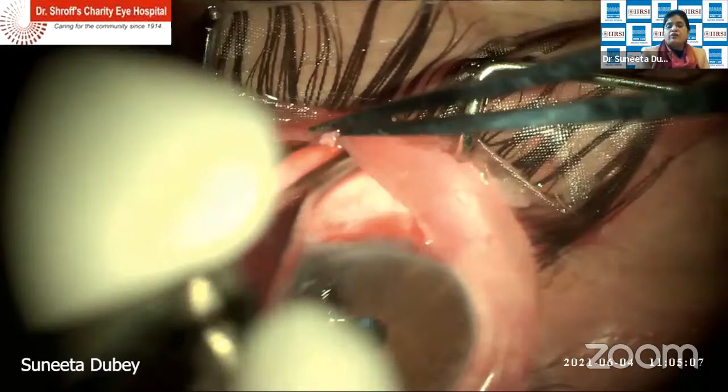So anyone, Dr. Reena, you have been using Ologen? I use Ologen, but I never use Ologen in combination with an anti-metabolite. I choose Ologen in some situations, like high myopes, where I'm worried about mitomycin C related complications in the post-operative period, long-term complications, especially in young myopes. And the whole idea is to do wound modulation using it.